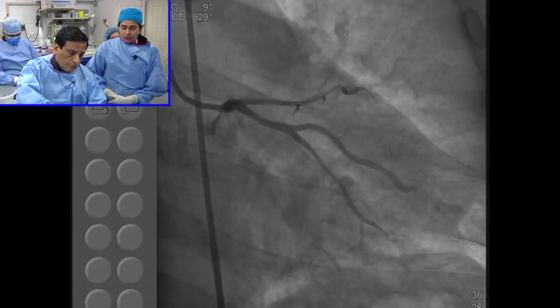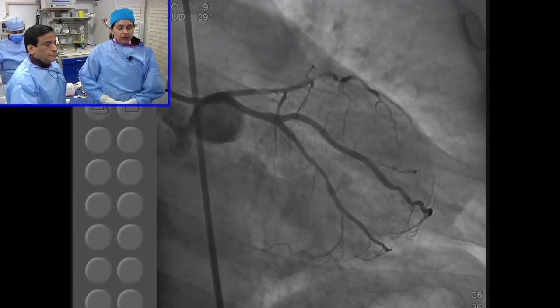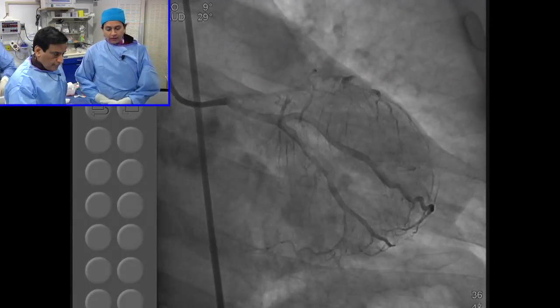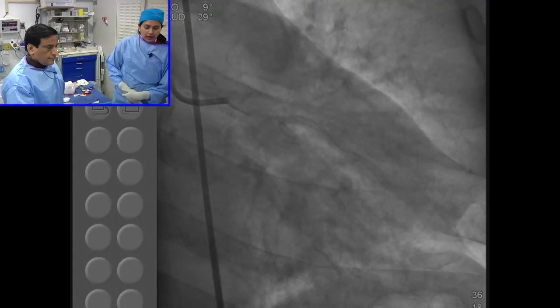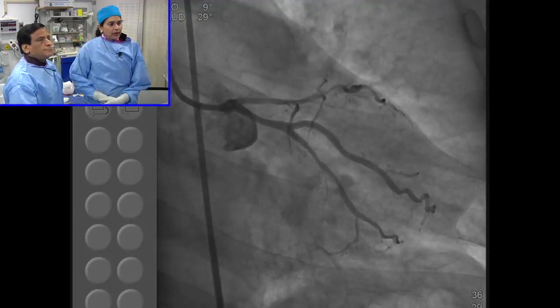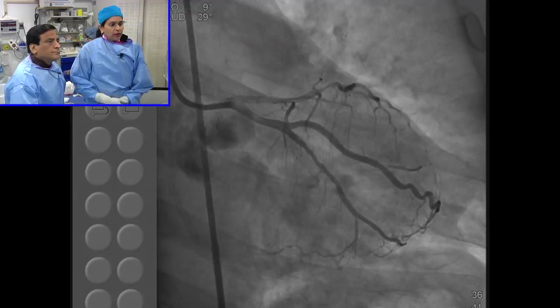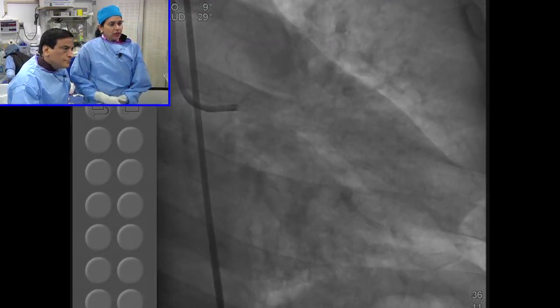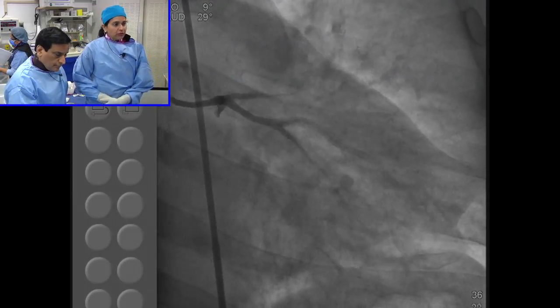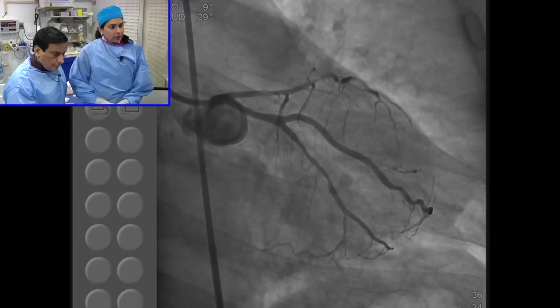V stenting is when there is a 2 millimeter carina. If you have more than 2 millimeters, then we call it SKS. But we are talking about a side branch of 2.75 or greater and a proximal main branch of 3.0 and larger. Otherwise, in the majority of cases, the preferred bifurcation stenting at our institution is what we just showed, the micro or mini crush, where you pre-treat both the main vessel and the side branch. If there is calcium, you may have to do rotational atherectomy of the main branch and a cutting balloon in the side branch, with whatever cutting balloon you want.